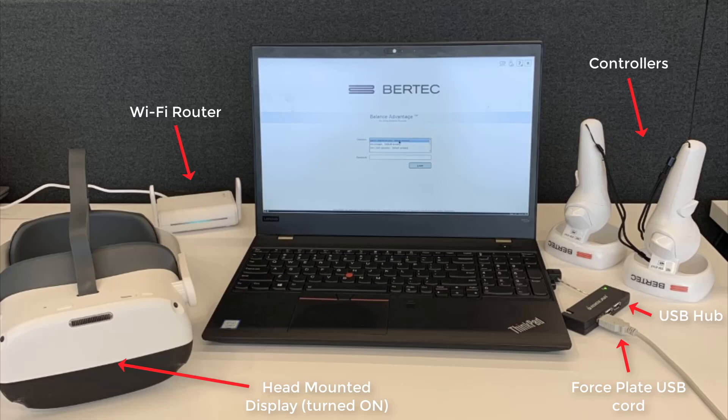For more USB ports, plug the USB adapter into the side of the laptop. You may then plug in the force plate via the USB cord.